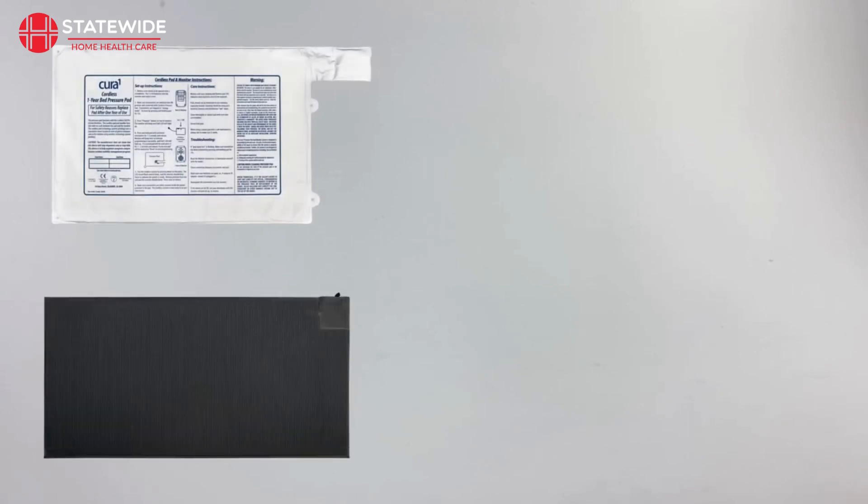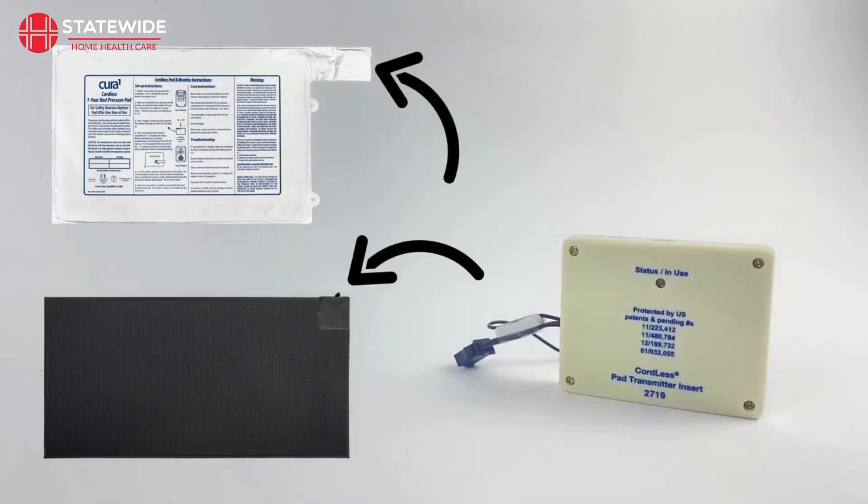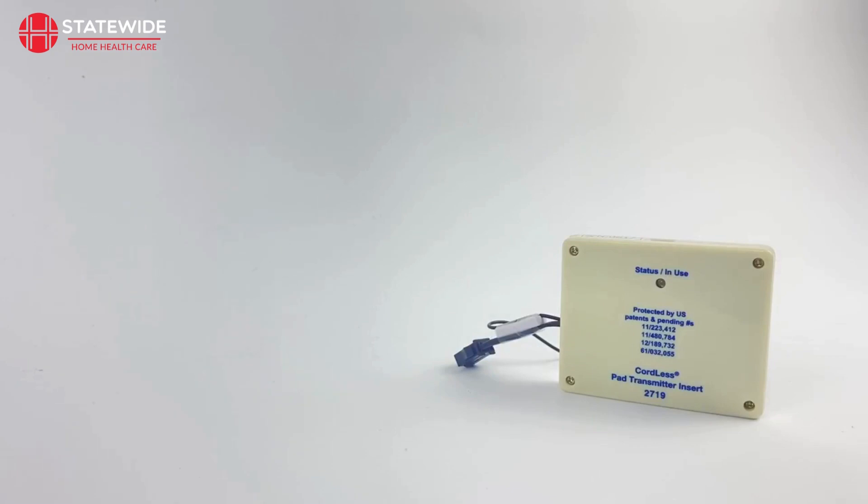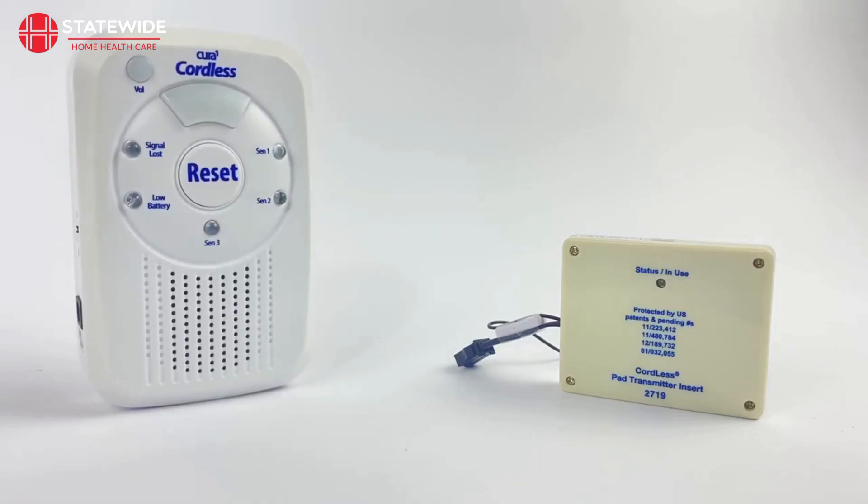There is a good chance you may be using a pad or mat with your 3-channel monitor. Whilst these pads and mats don't use batteries themselves, the transmitters they use do. When the transmitter inside your pad or mat nears the end of its battery life, it will struggle to stay connected to your monitor. This will cause the monitor to illuminate the signal lost indicator, and it means it is time for the transmitter to be replaced.